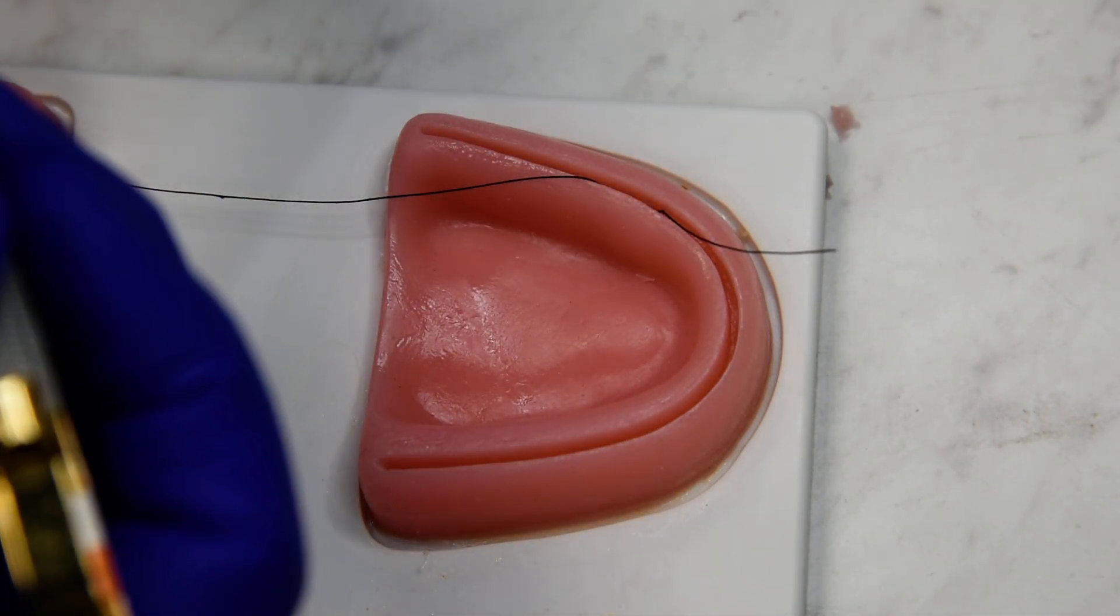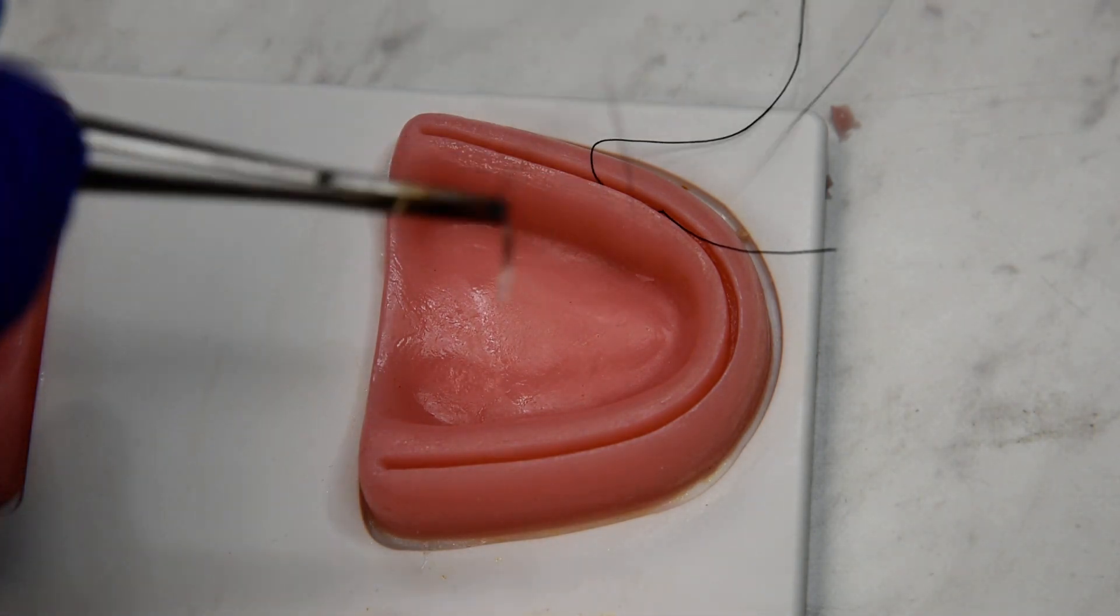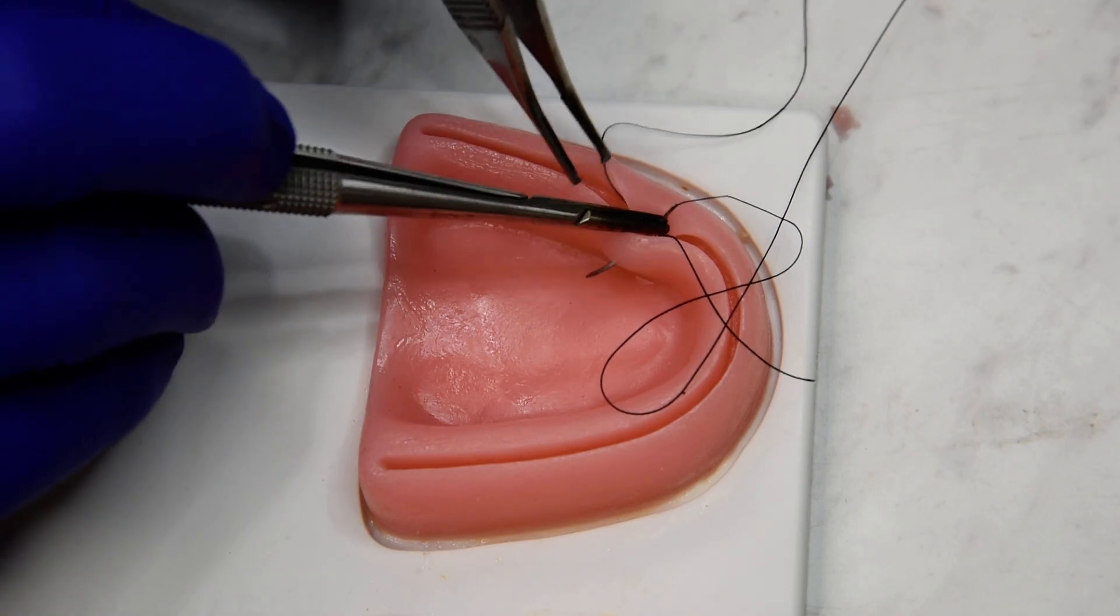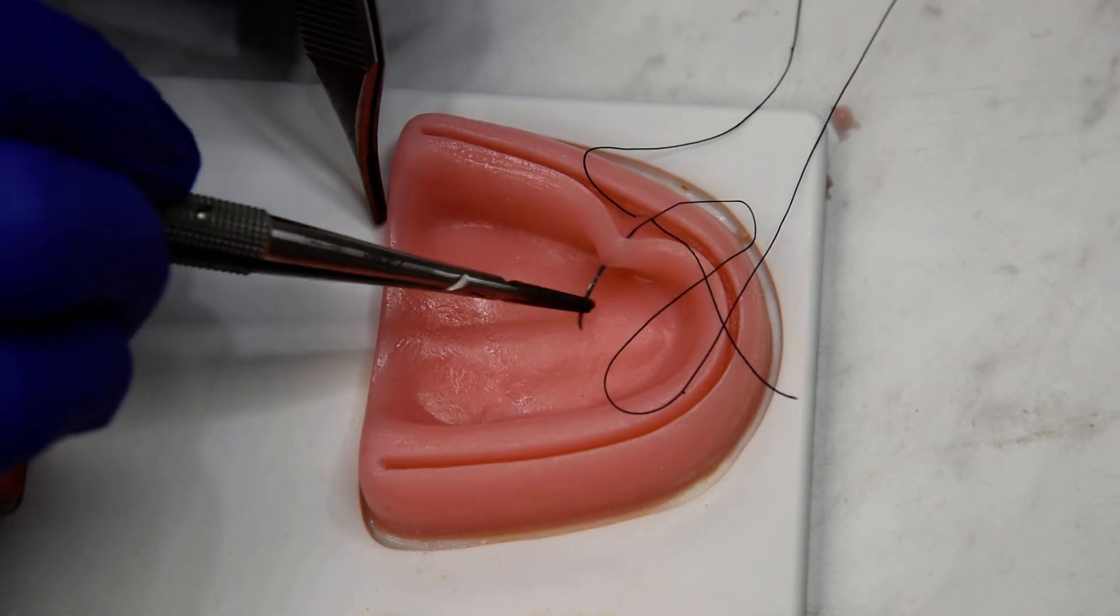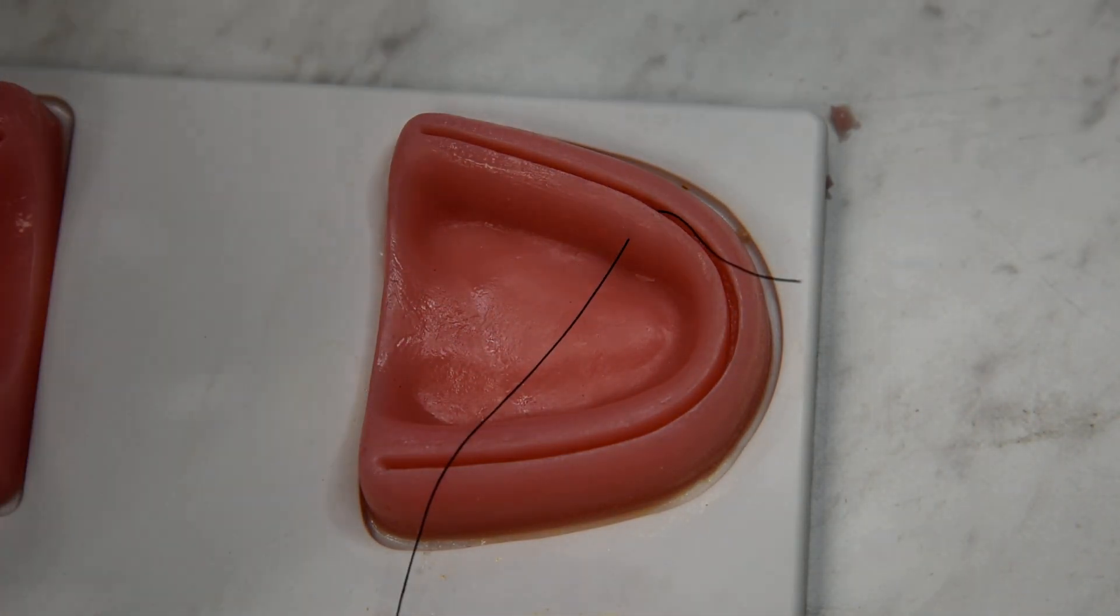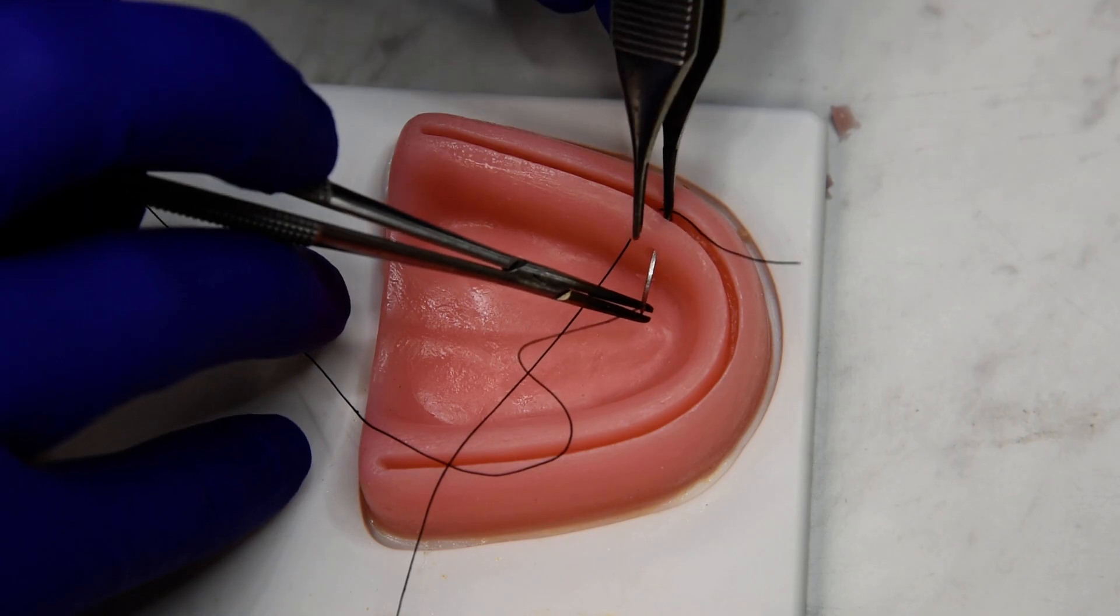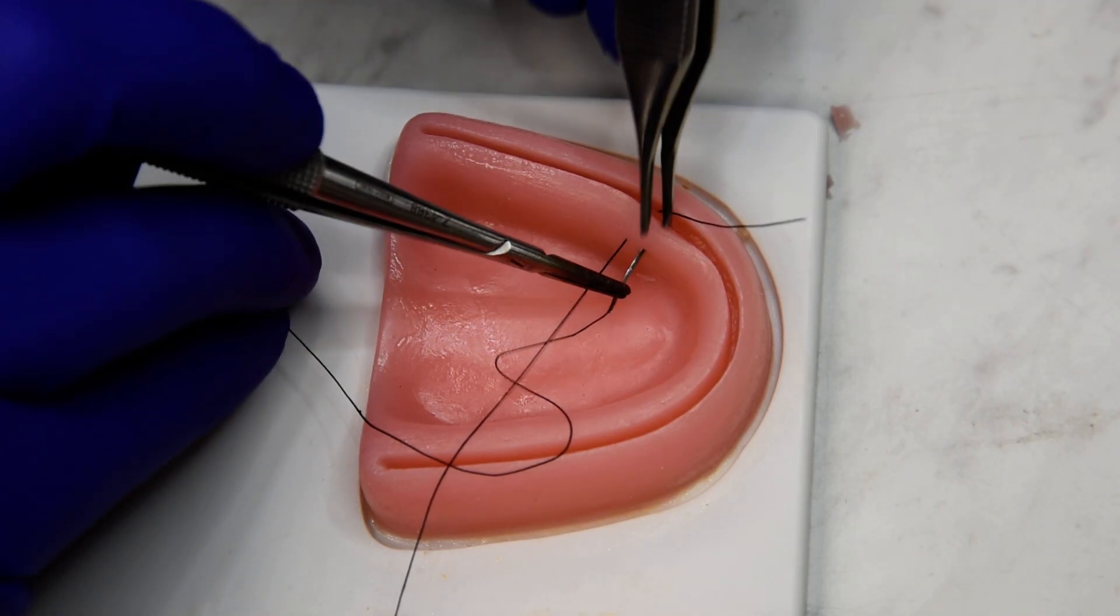And then the next bite is in and back out and back into the palate. So here we're taking a bite out of the lingual, and back in. So we're going to have a loop similar to a mattress on the lingual.